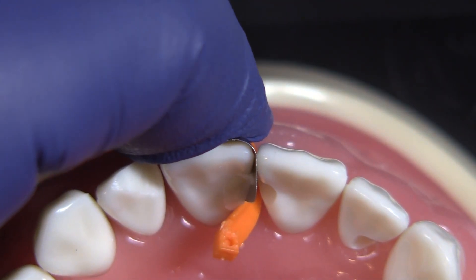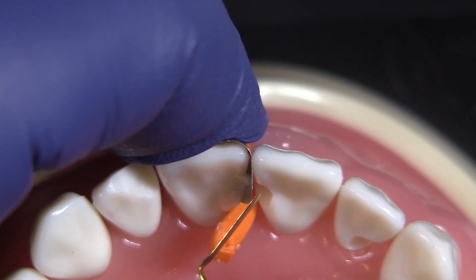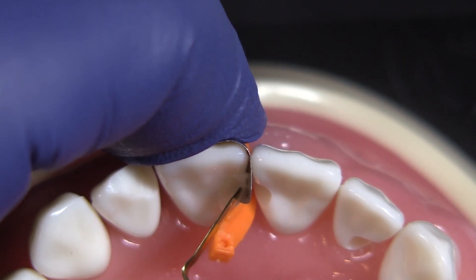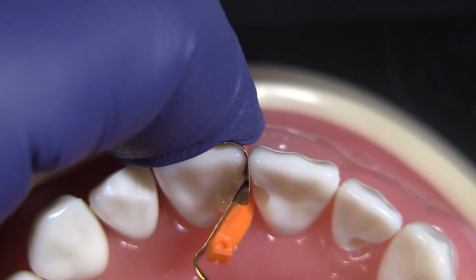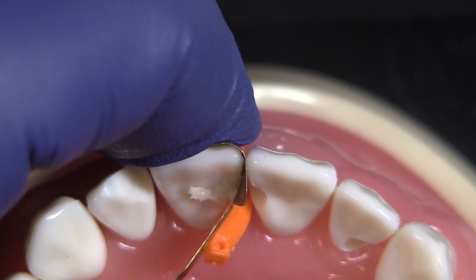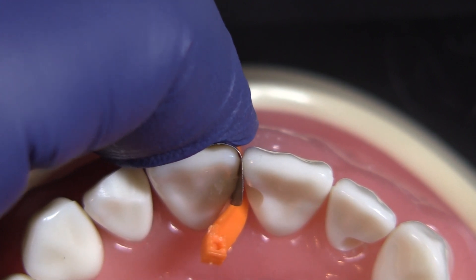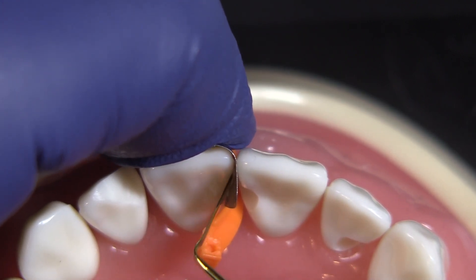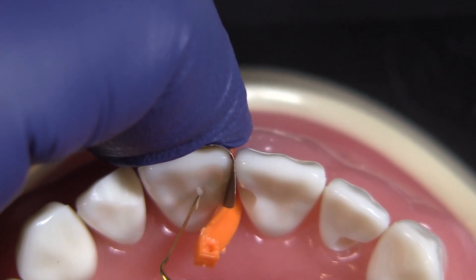Now, what I will do from here is take a flat instrument like this and guide that instrument using that matrix, then kind of pull towards the tooth to help bring that composite, especially down here by this wedge — bring that composite over, get rid of the excess. And then once I have everything where I want it and it looks good, I will have the assistant cure that.